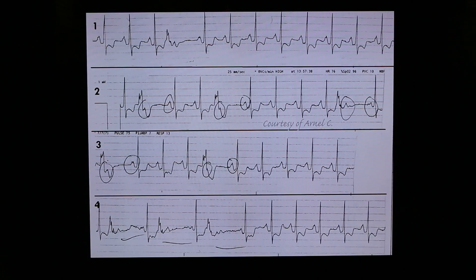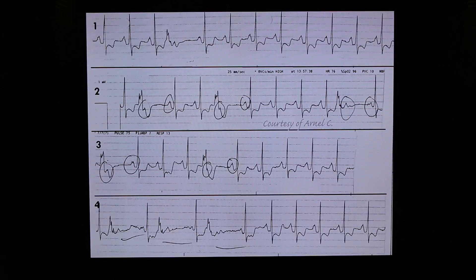However, this EKG pattern is a manifestation of concealed conduction. Concealed conduction would simply mean invisible conduction in the surface EKG. In this case, we are talking of concealed conduction of PVCs.